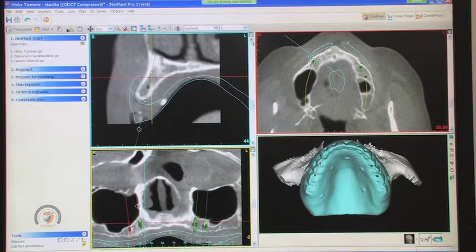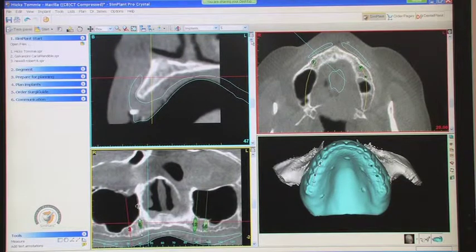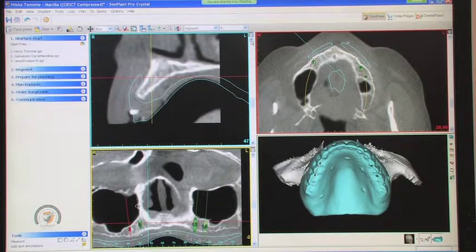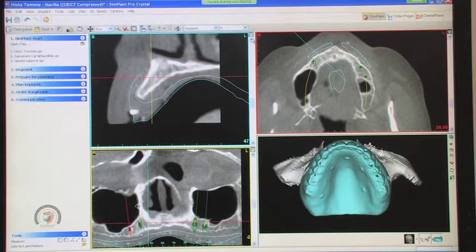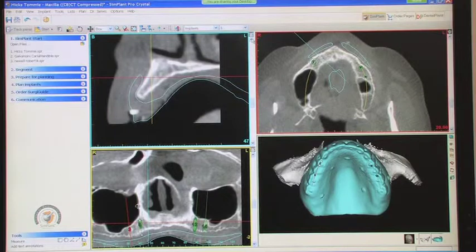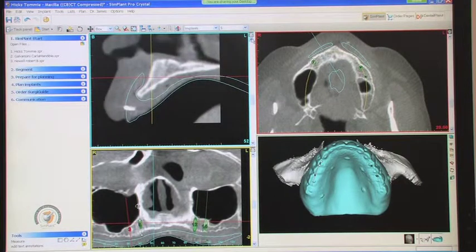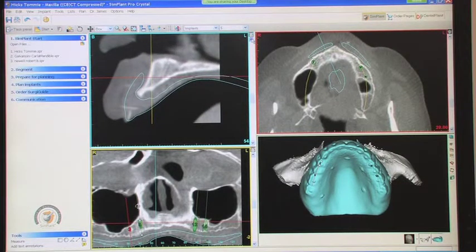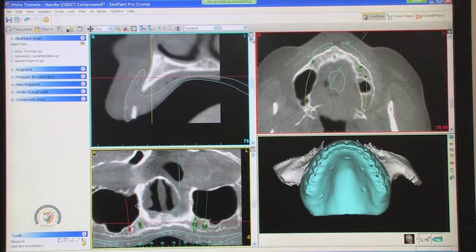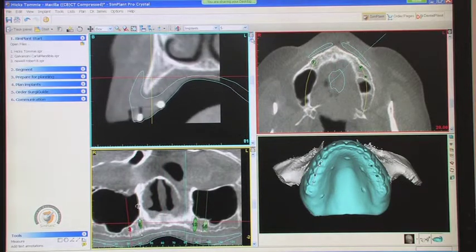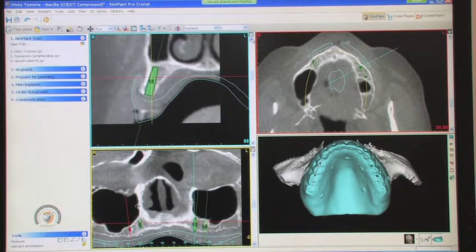Going further mesial you can see where things fall off. It's not possible to get anything further mesial than the implant we have planned without doing some grafting or ridge splitting. Moving around to the other side, this is the number 12 area.